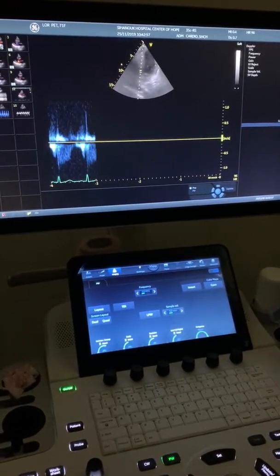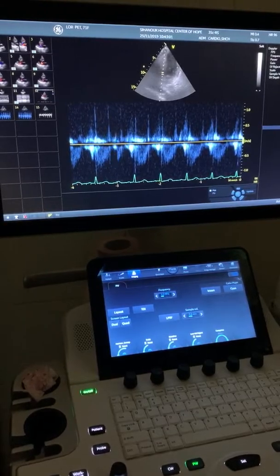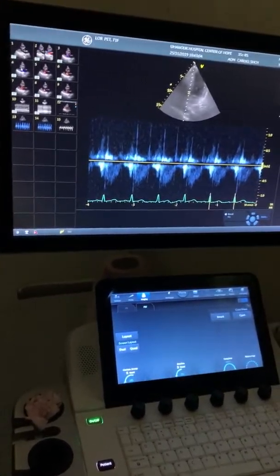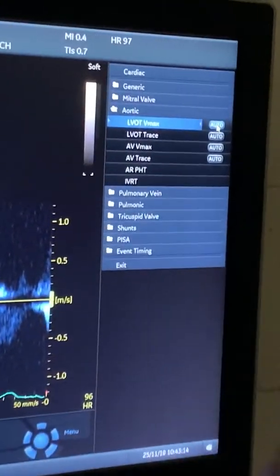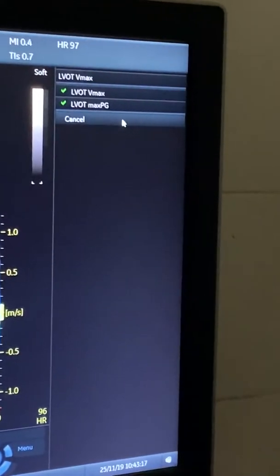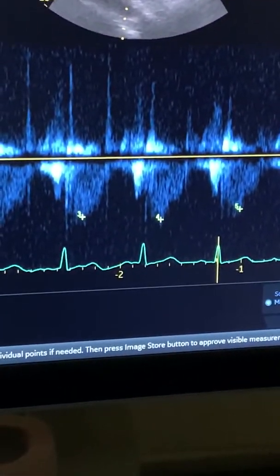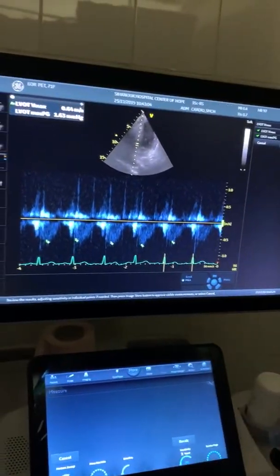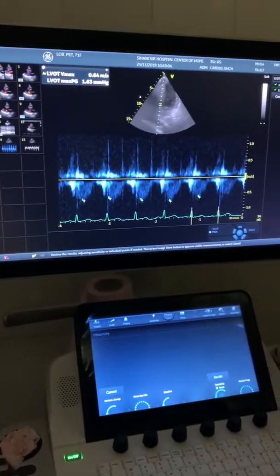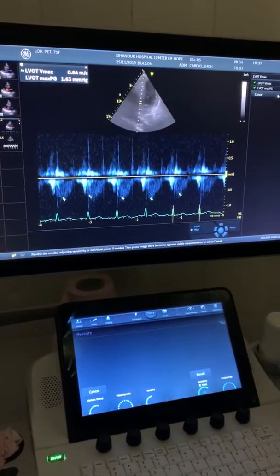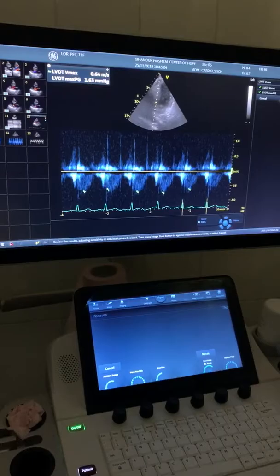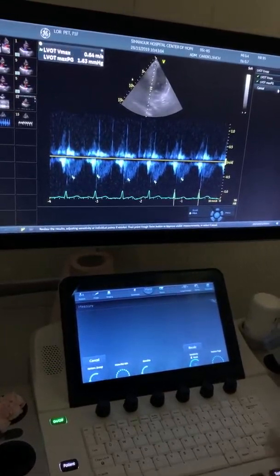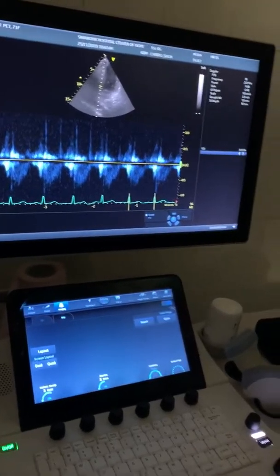This is the aortic valve - LVOT. So if I go to measure, let's see if I got a good wave. I press auto. If you got AF you're happy, you don't have to measure one by one - it will show you the average. It never happened because no one showed you yet - don't worry, doctor, now you know.